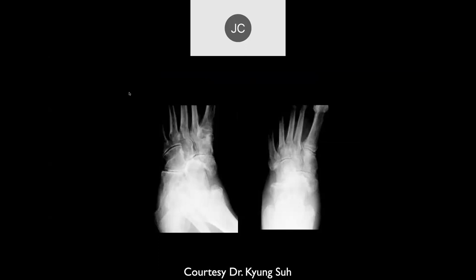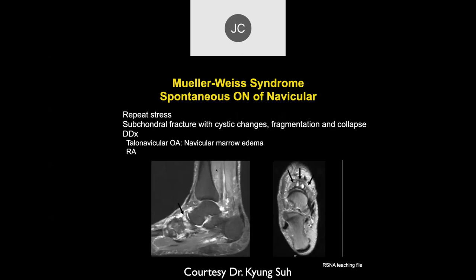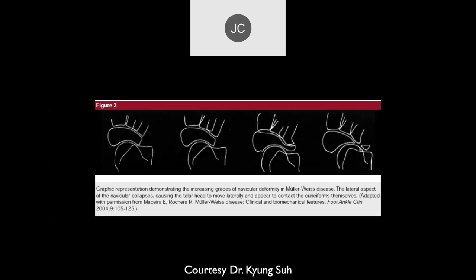Looking at the navicular bone, the central and lateral portions are more sclerotic and markedly flattened laterally, possibly slightly rotated medially. On MRI, cystic changes are visible — typical of chronic repetitive trauma seen elsewhere in the body. There are different stages depending on the amount of trauma involved. With enough compression fracture of the navicular, you can get a bipartite navicular where it actually separates into two fragments. This is end-stage Müller-Weiss syndrome where the navicular bone has essentially been destroyed.